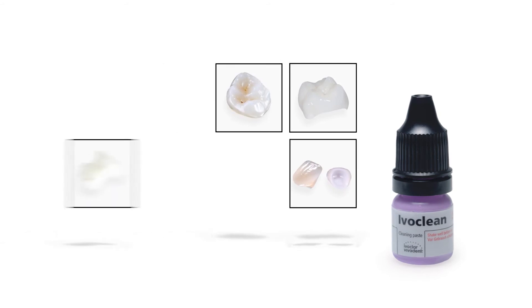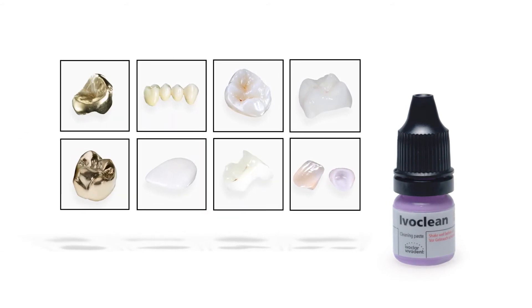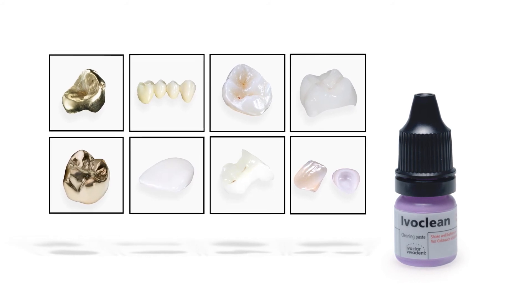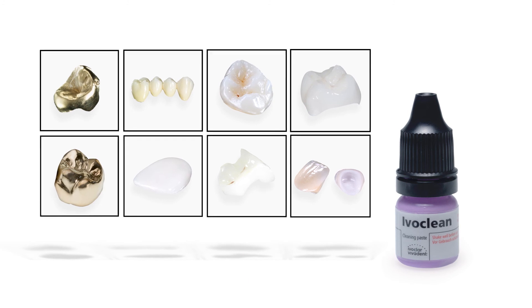IvoClean is effective on all ceramic and metal restoration surfaces, making it the universal solution for the effective cleaning of restorations after try-in.